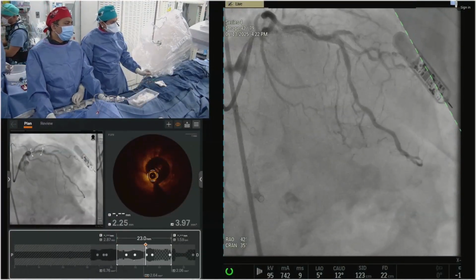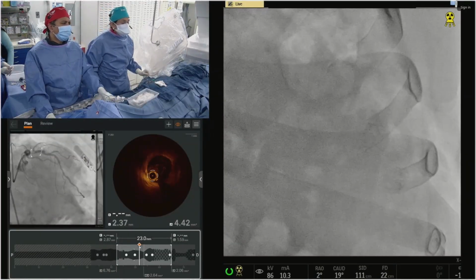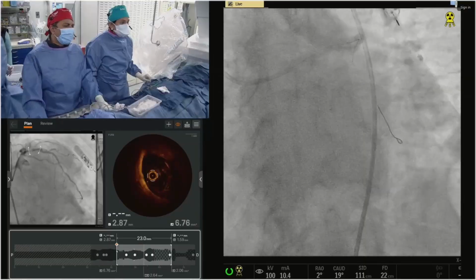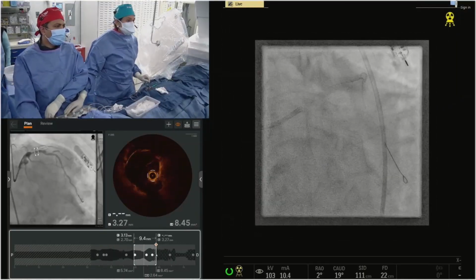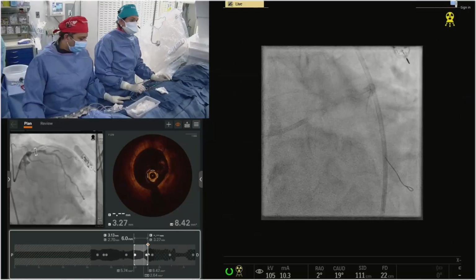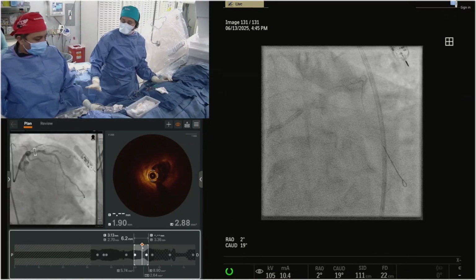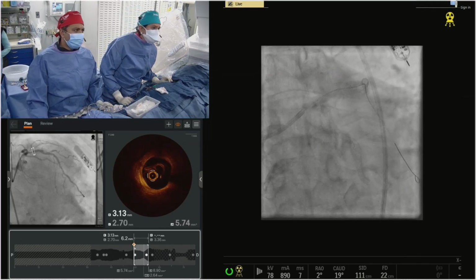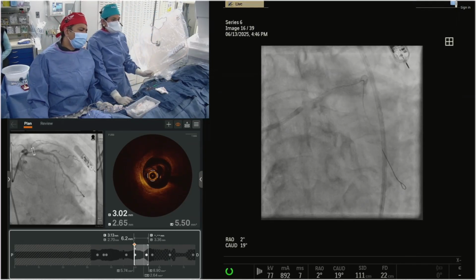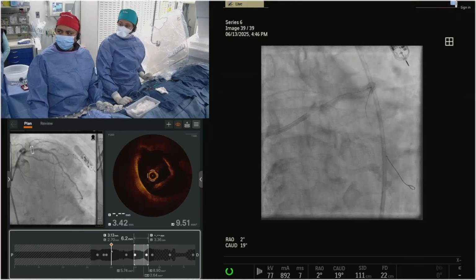Maybe. Well, what about the experts here? Dr. La Sala, tell us what to do now. Well, if we've agreed there isn't a whole lot of superficial calcium, all of it's got to be deep based on the angiography, correct? Just saying, for some reason, this is the first case in my life in which I don't believe the OCT. I think that lesion is calcified.